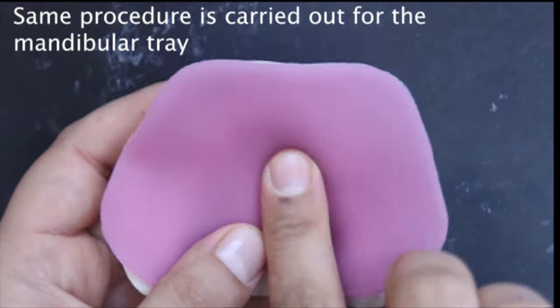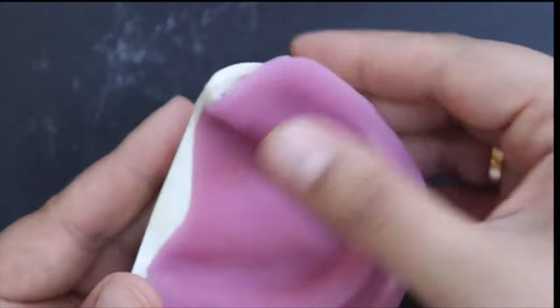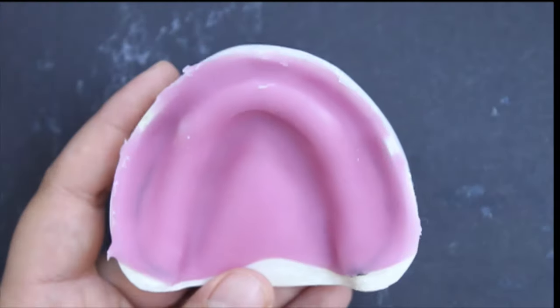Follow the same steps to make the mandibular special tray. The only difference is that you need to provide tongue space. So remove excess material from the lingual sulcus and then cut the tray 2 mm away from the full depth.